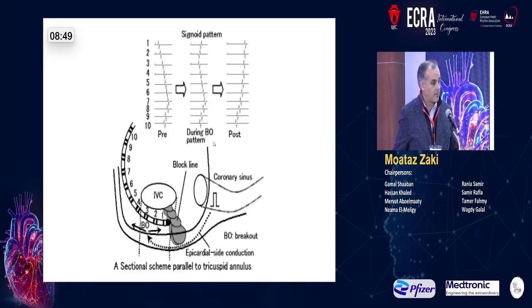Such cases are very difficult to know, and they are very difficult to treat by re-ablating on top of the same line. We have to see where the breakthrough laterally is as a focal point through 3D mapping, and then we ablate on top of this breakthrough point. And at that point, you can acquire the usual pattern of conduction block across the isthmus.